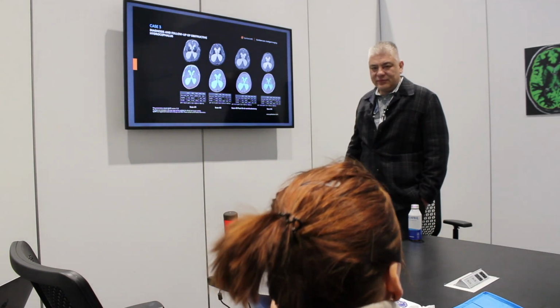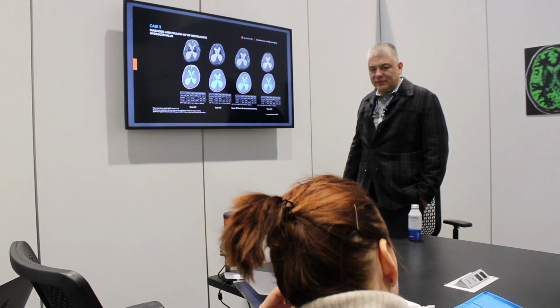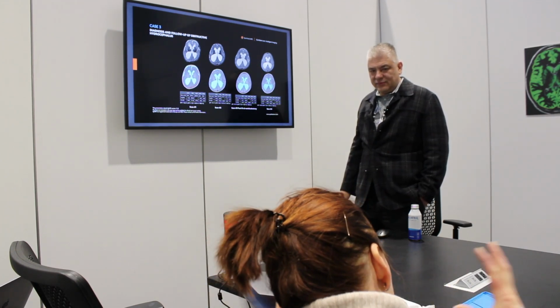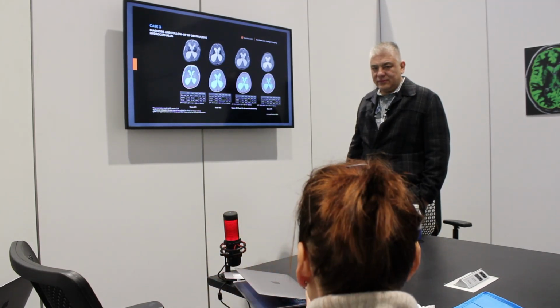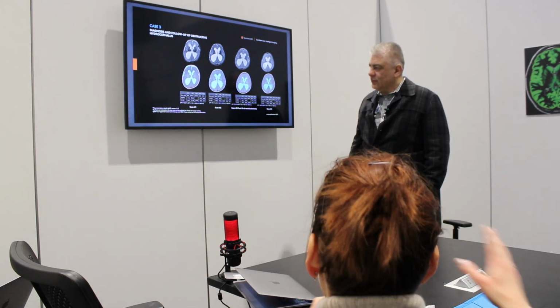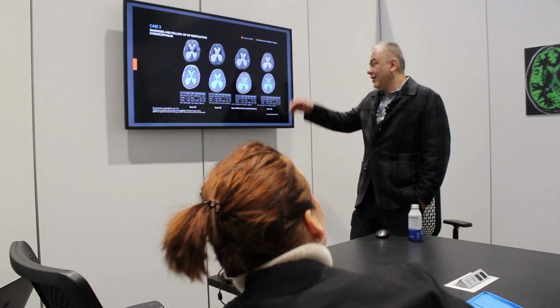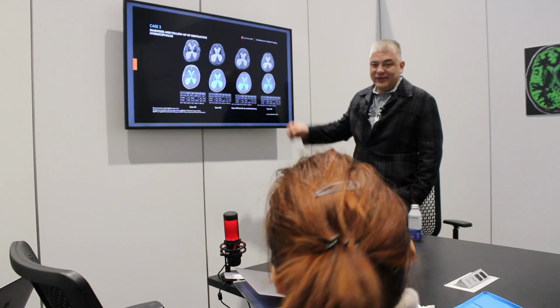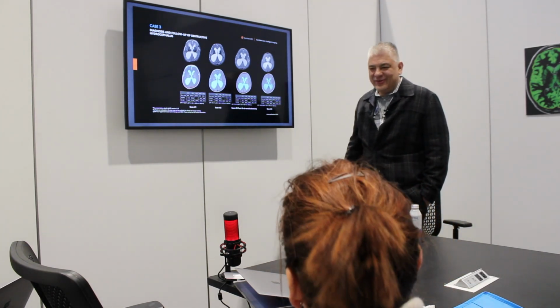But we could maybe assume that there's quite a lot of CSF that is now not in the subarachnoid spaces anymore, and we actually underestimate the volume that goes in the subarachnoid spaces. I'm just saying. I don't know either. Physics-wise, it's going to be hard to say. It's very, very hard to measure, but possibly that space is bigger than we think it is.